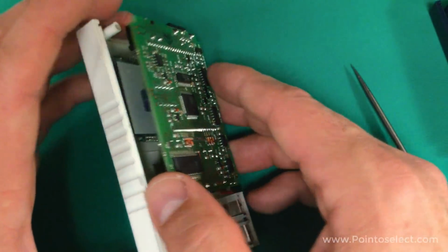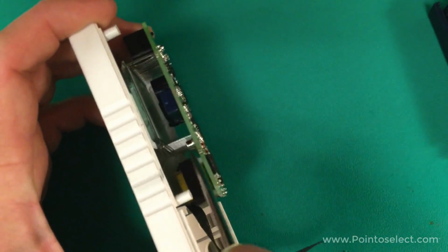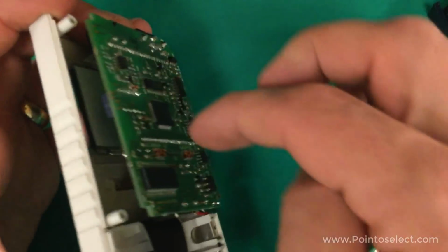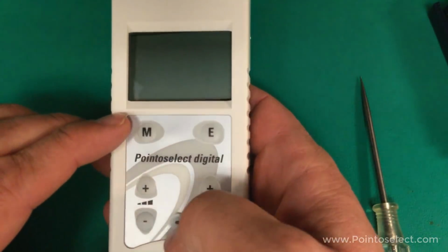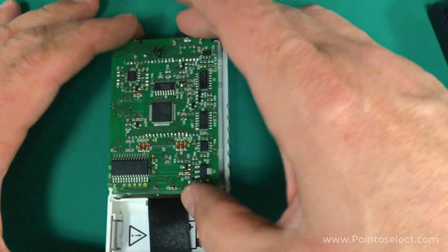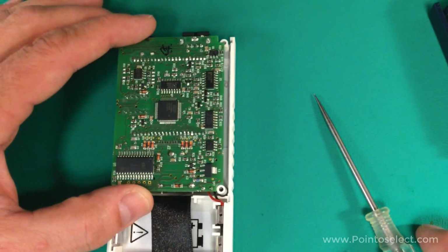All right, so I can't pull this off. There's a ribbon cable in here, right there, that connects the circuit board to the membrane switches on the front. And so I would have to unsolder that to take that out. But I think we can see everything we need to see on the board here.